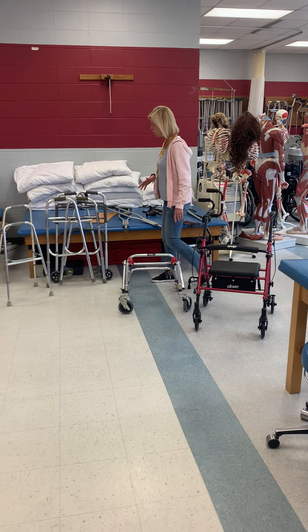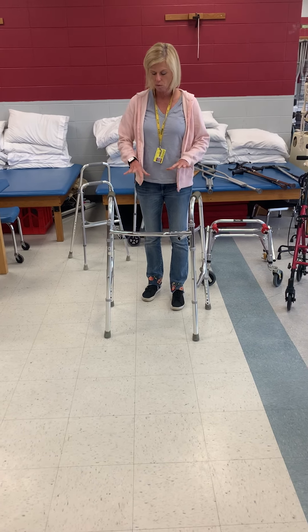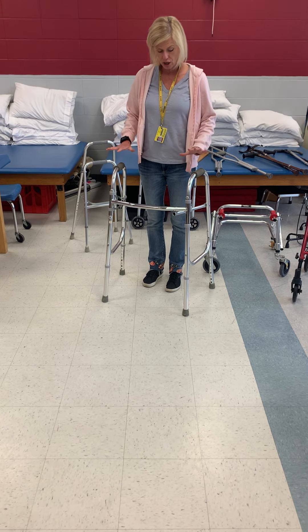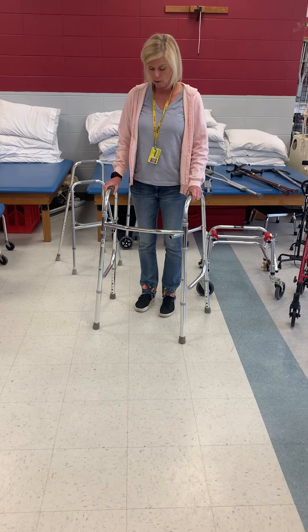We're going to look at a couple of different types of walkers. This is your standard collapsible walker. With this walker, there are no wheels. It's going to allow for a slower gait pattern, and it's more stable than a rolling walker.